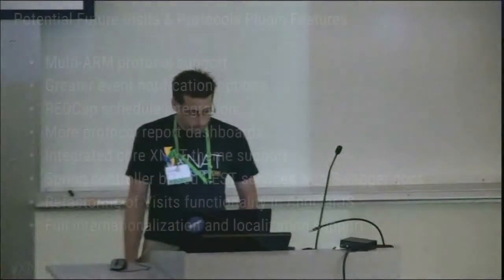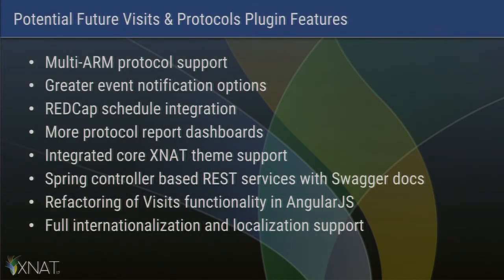And then I want to refactor a lot of this. A lot of the newer stuff was done in AngularJS, which is really kind of fun. If you guys like developing stuff, I'd recommend you check that out. And then also, it's pretty much set up for full internationalization. Not that the rest of XNAT is, but it probably should get there too.